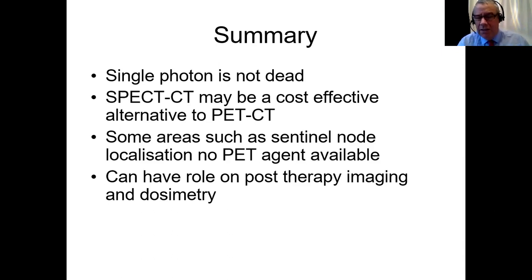But it is all getting a little bit more technical, and soon we'll be able to do things like dosimetry and patient-based dosimetry based on SPECT-CT with good, accurate localization and uptake. So the SUV SPECT-CT is getting almost as good as the SUV PET-CT.